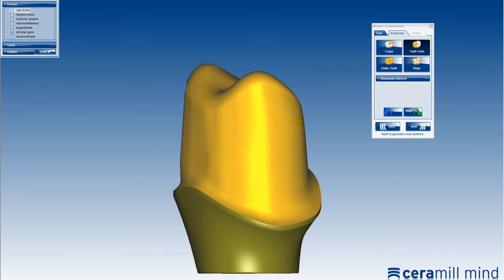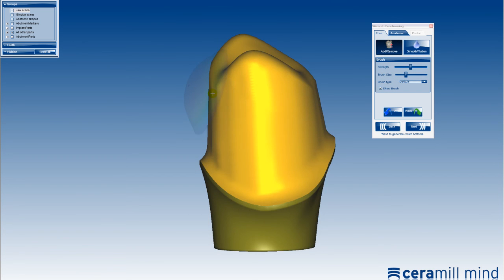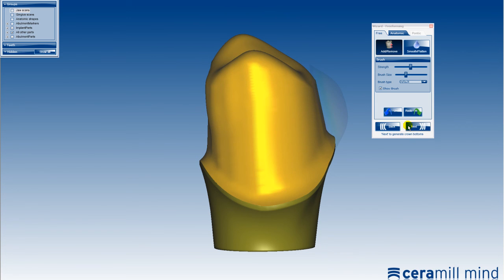Any undercuts generated are blocked out automatically by adjusting the shape of the abutment. Construction of the abutment is completed by pressing the Next button.